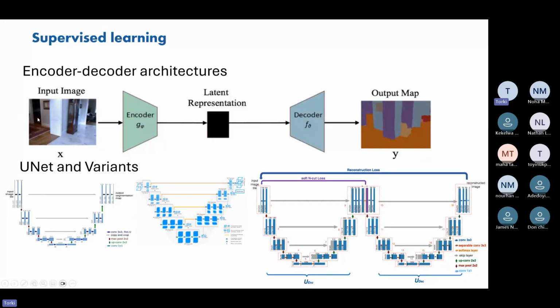So how is this related to our semantic segmentation tasks in dentistry? Here you have a panorama X-ray, and here you have the masks that you are trying to find. So as you can see on the output map, we need to predict the masks.